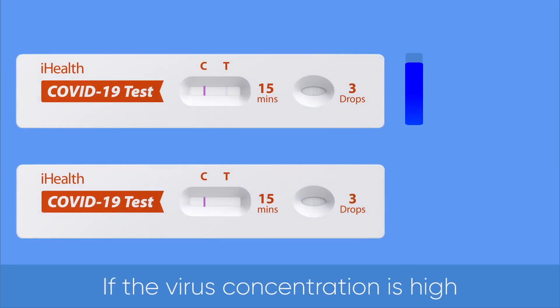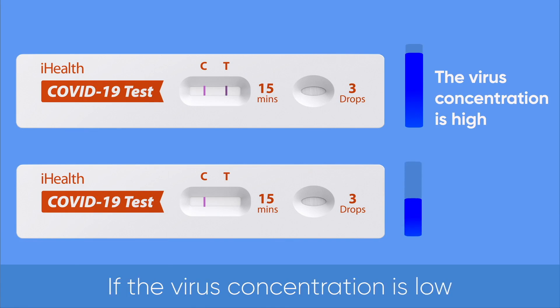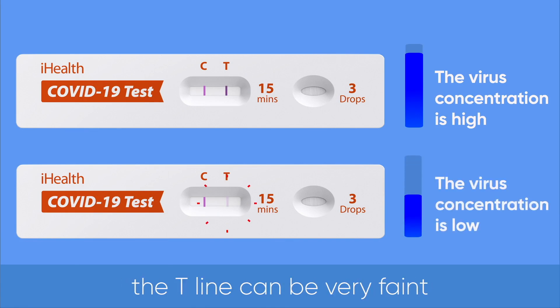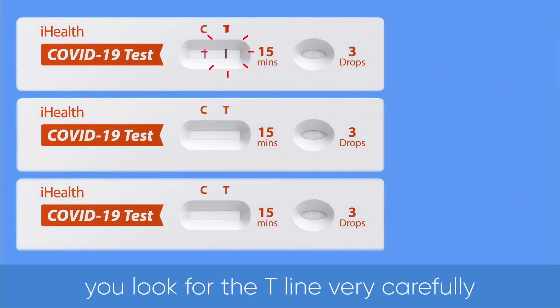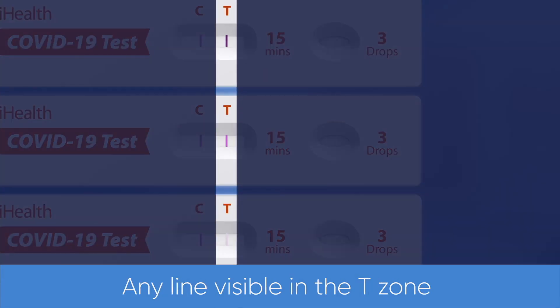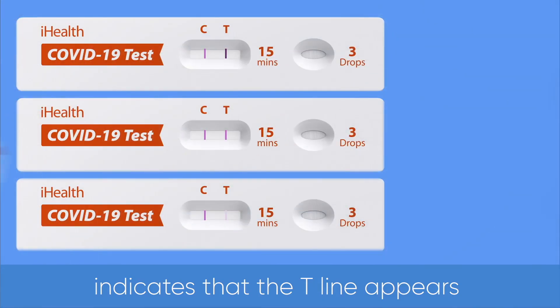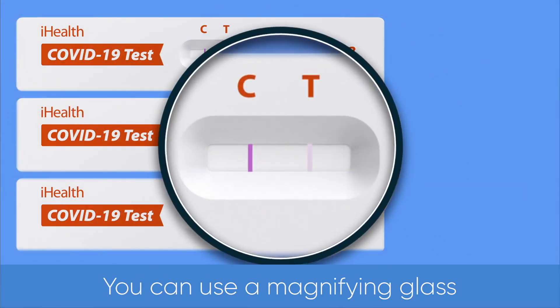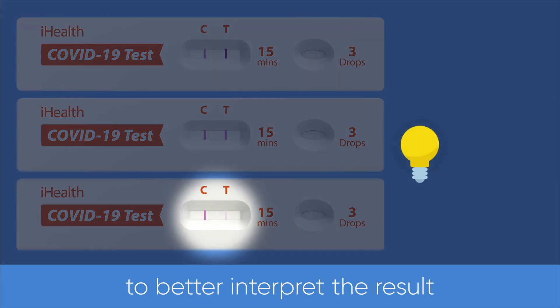If the virus concentration is high, the T-line will be dark. If the virus concentration is low, the T-line can be very faint. Please make sure you look for the T-line very carefully, as it can be very faint. Any line visible in the T-zone indicates that the T-line appears. You can use a magnifying glass or place the test card in direct light to better interpret the result.